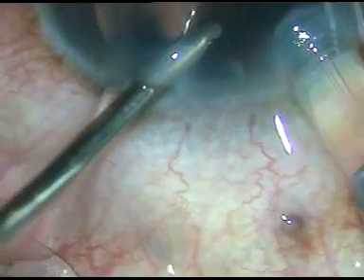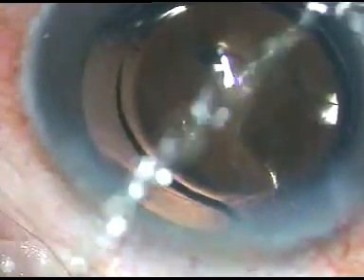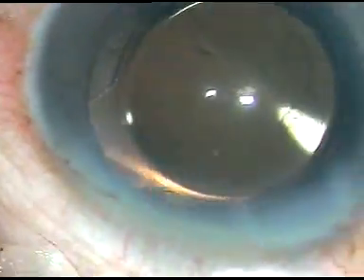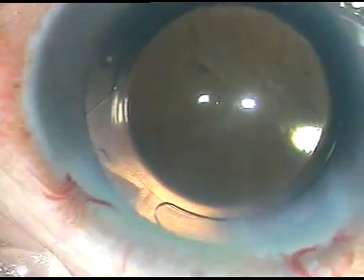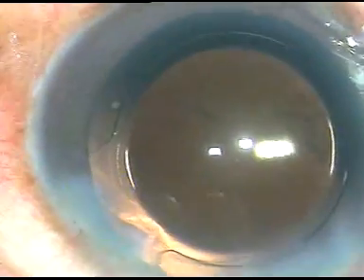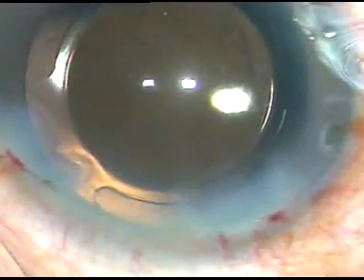Friends, this is an unedited video done in five and a half minutes. Both the haptics have gone into the capsular bag. The beauty of implanting the lens under irrigation is that the anterior chamber is free of viscoelastic substance. Though there is some viscoelastic substance in the lumen of the cartridge, it is very minimal and will come out during the final wash. Moxifloxacin has been injected just now. Now hydrate the only one side port that was made in this case, and now I am going to give the final wash with BSS.